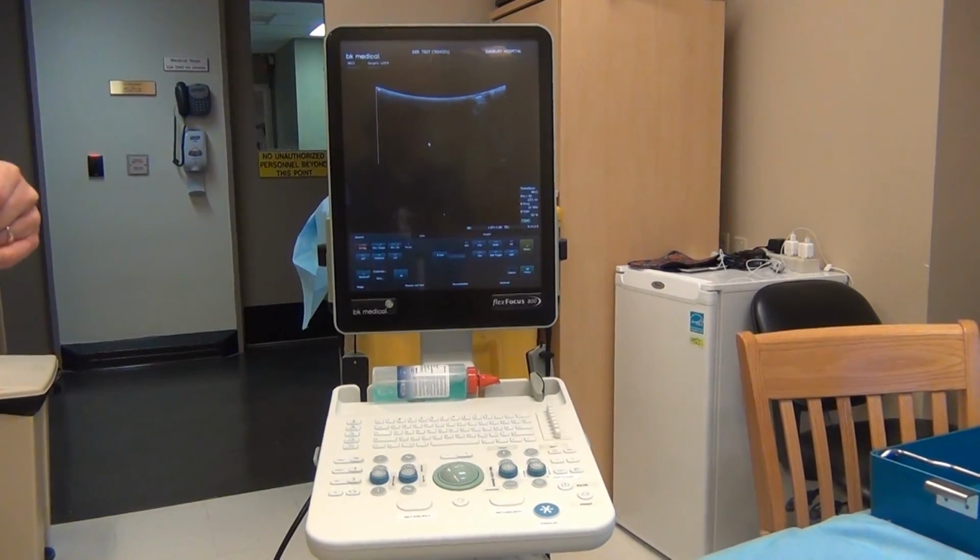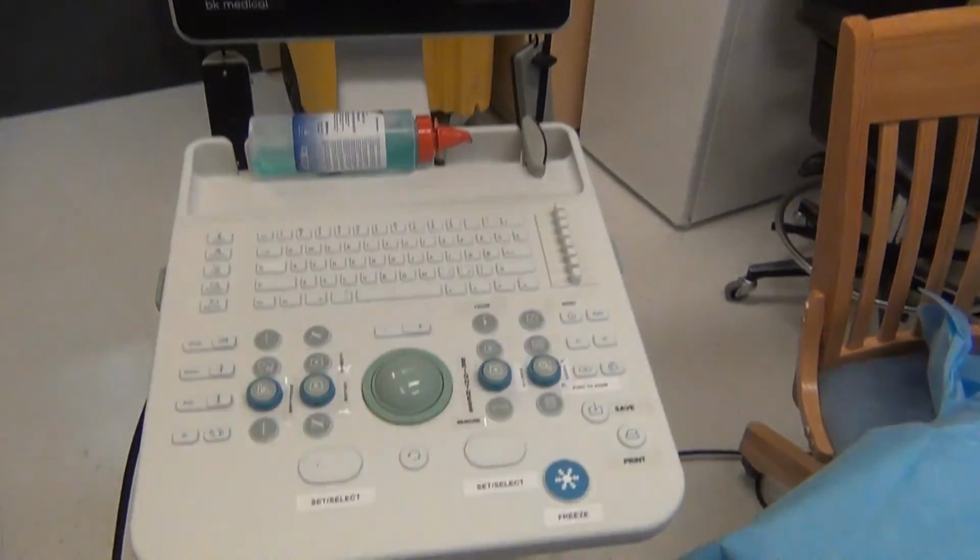Okay, so just going to turn off the button.